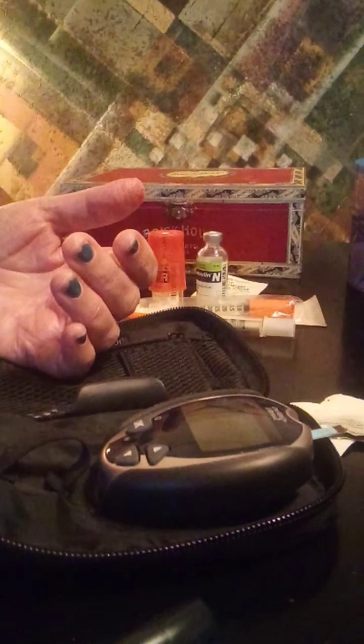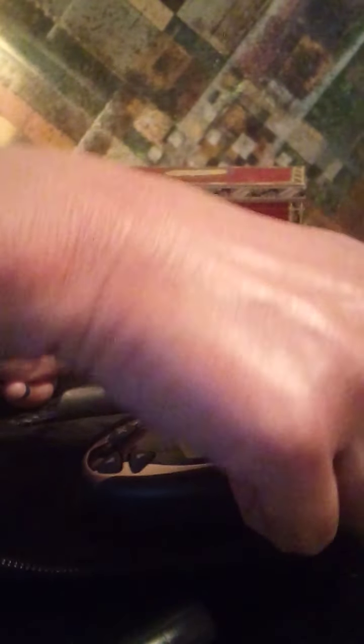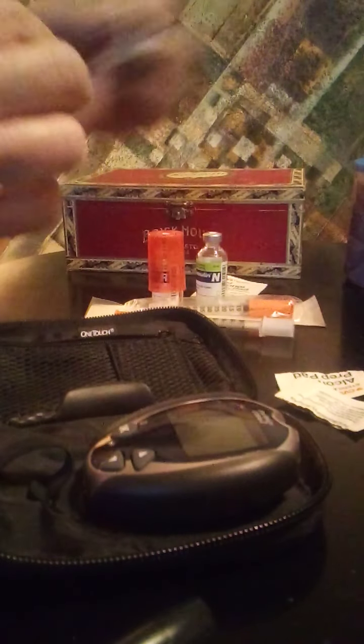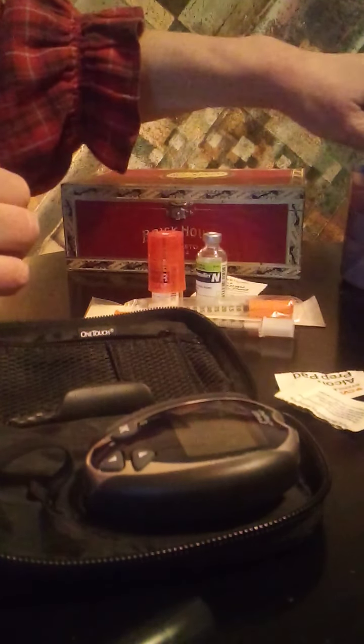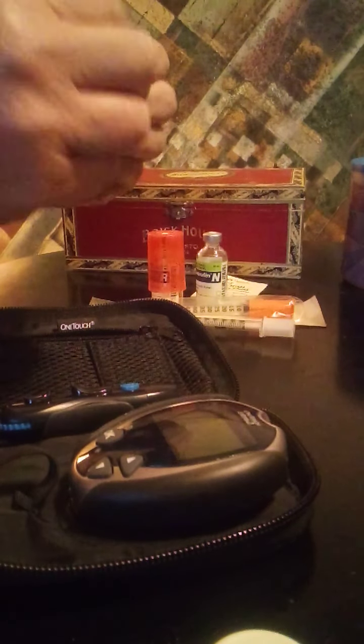That went in there slowly — I might get an error. My blood sugar is over 600, so it will not show on the meter. I can only assume 600; I can't know for sure what the true amount of my blood sugar is. So what I'm going to do is go ahead and shoot up my long-term insulin first.